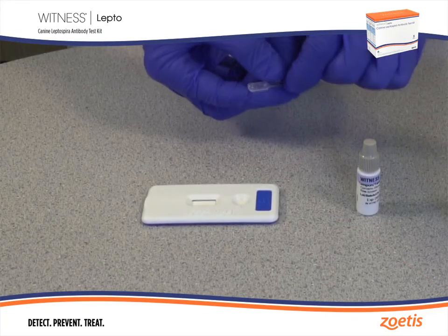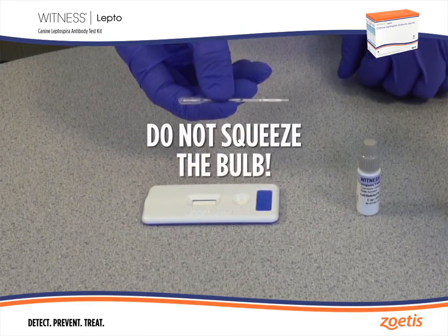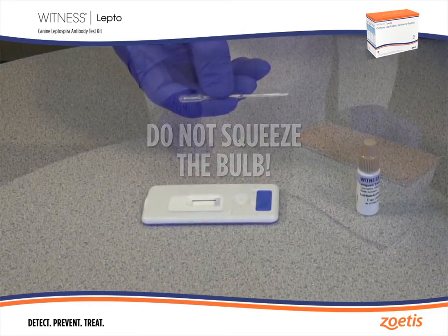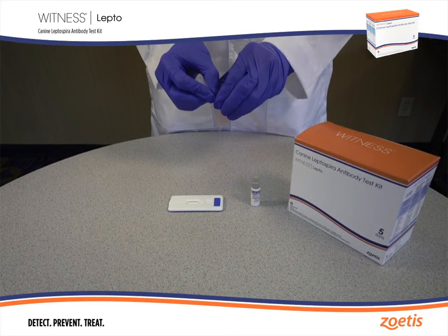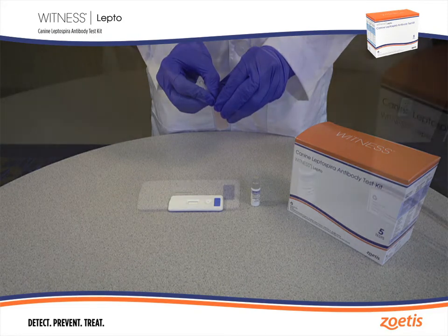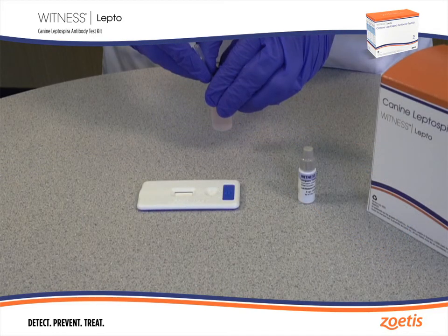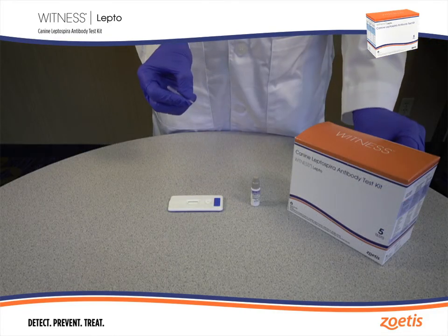Gently grip the stem of the pipette. Do not squeeze the bulb. The pipette will fill automatically by capillary action when placed in the sample. Hold the sample tube at an angle to allow proper filling of the pipette. The capillary tube in the pipette will fill automatically in two to three seconds. Remove the pipette from the sample when the tube has filled.